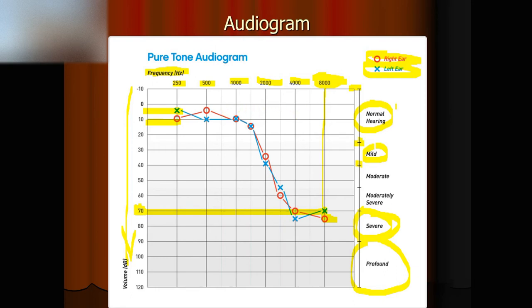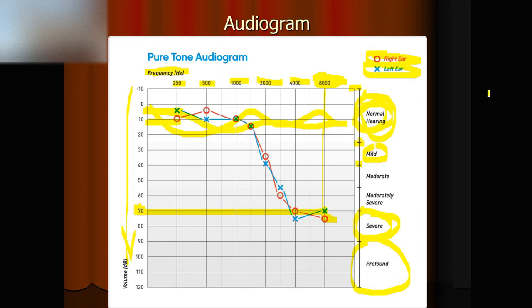How does a normal hearing person's audiogram look? If a person has a normal audiogram, both the left ear and right ear curves are within the range of normal hearing. That's a normal hearing audiogram.